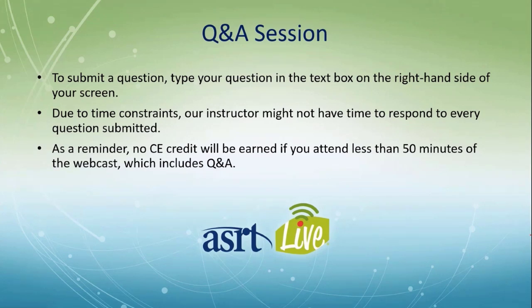That's a different question from asking whether the computer processing a regular image that has been scattered in exposure, that has some low contrast during the exposure, is able to go in there and adjust for that scatter and compensate for it. So in other words, pre-fogging a cassette is a little different question than asking whether the whole system as a whole, including all of the digital processing, is able to cope with scatter radiation in general. And I still assert that it is, and so much more so than we used to be able to with film and screen imaging.